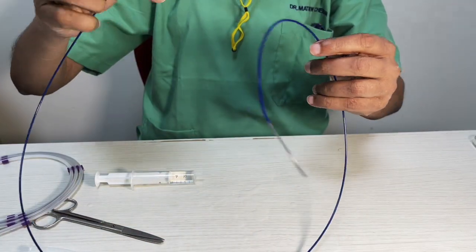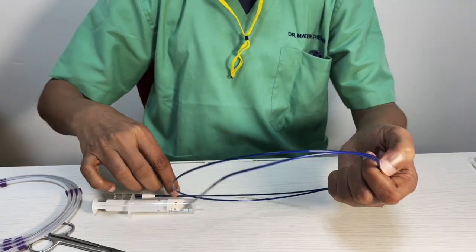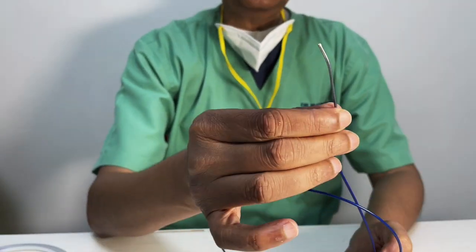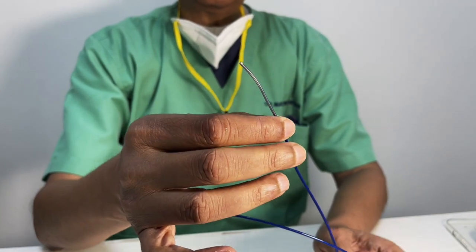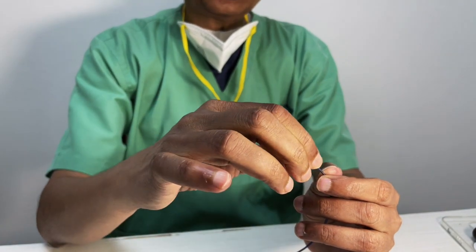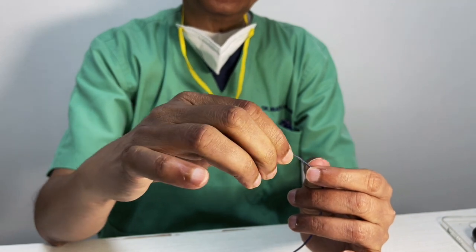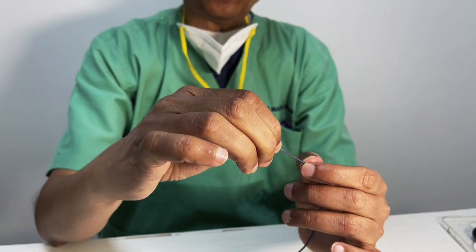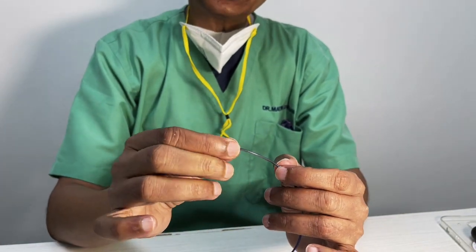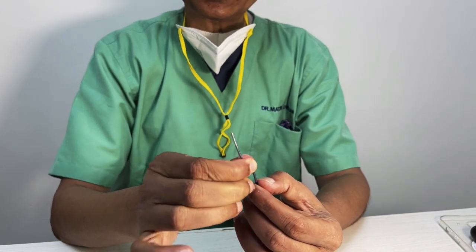So what they have done is they have made a catheter very, very similar to that of the Neuron. And here they've again used a distal spiral. You can see the distal spiral. And it's very easy to know what the material is. Not a problem at all. All you have to do is just squeeze it. If it is squeezed and it stays squeezed, it's steel. Can you get this point? It is not squeezed. And they have used an alloy, which is again a nitinol based alloy, which prevents this kinking from taking place. Can you get it? It doesn't flatten. So that makes it an extremely good distal access catheter.